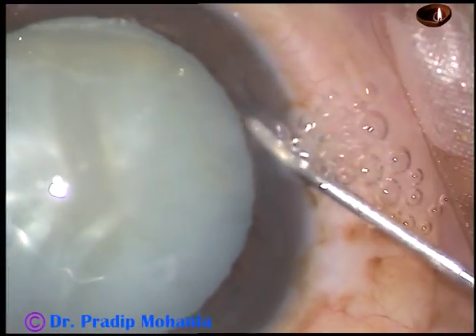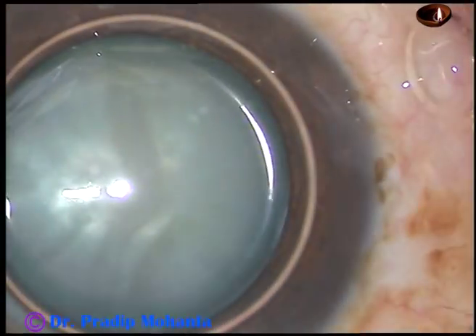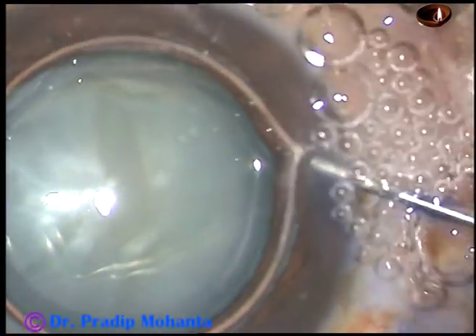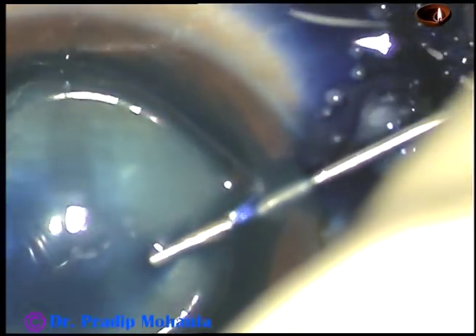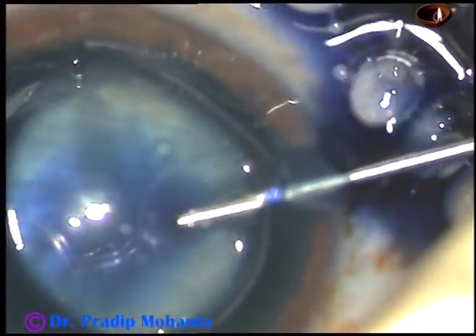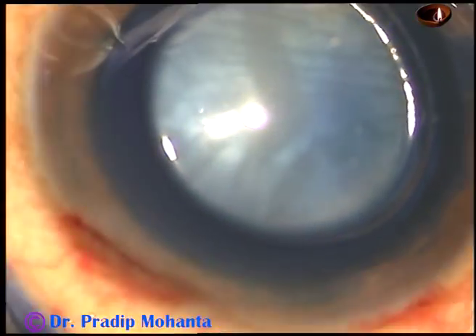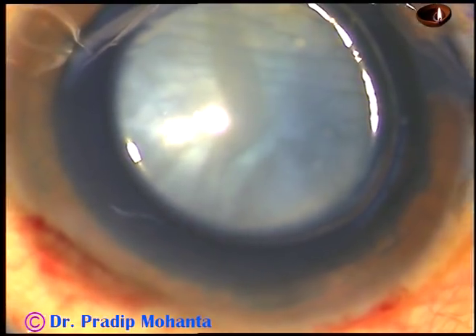And now this is an air bubble. I want to stain the capsule with trypan blue dye underneath this air bubble. Here goes the dye — trypan blue 0.06%. When you apply the dye underneath an air bubble, staining is immediate.